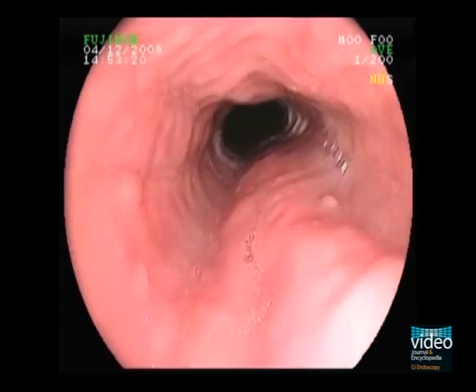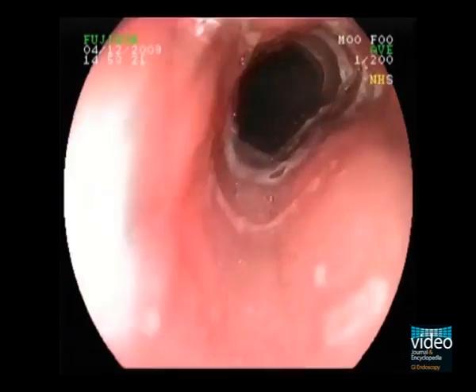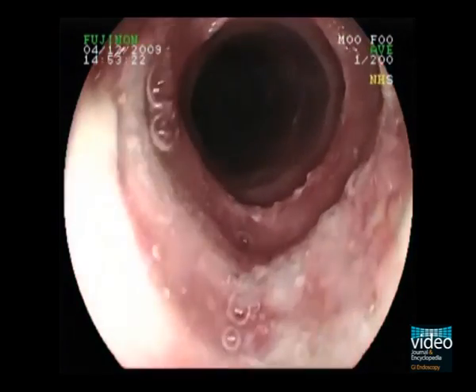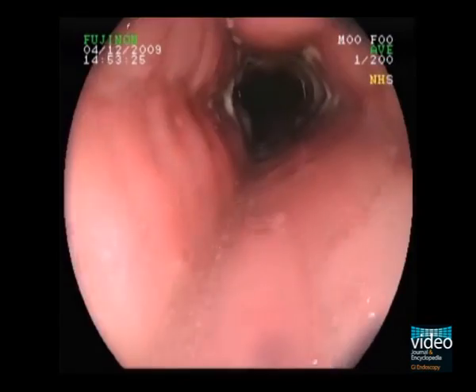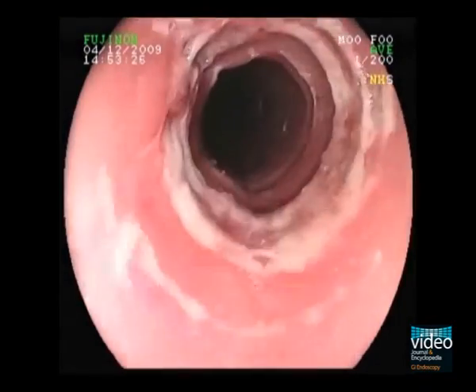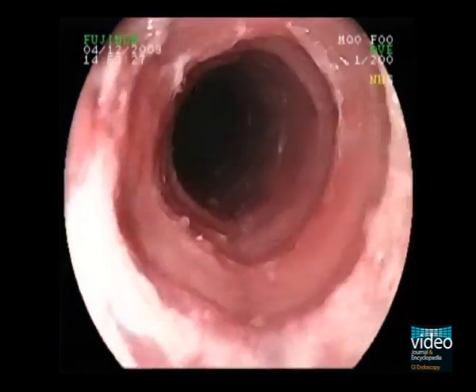This is a 41-year-old patient presenting with food impaction and dysphagia. As you can see, several mucosal abnormalities can be found.